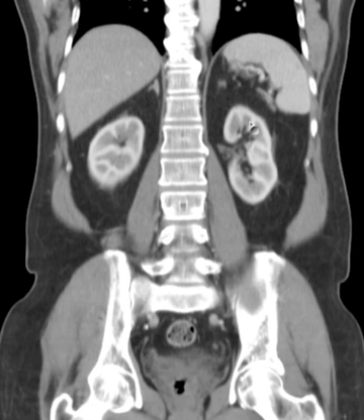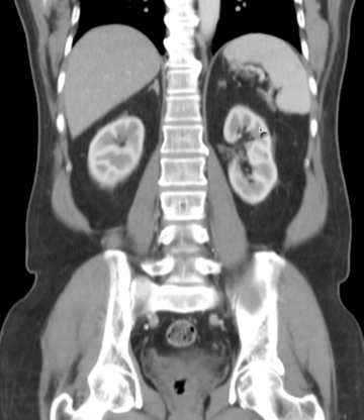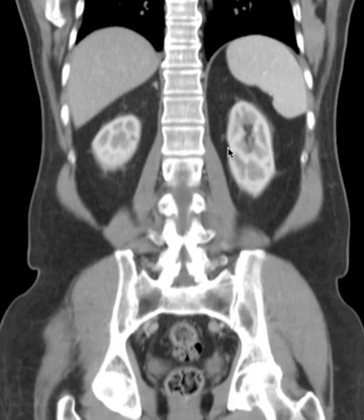Look at the nice corticomedullary differentiation. Look how the renal cortex is enhancing, but the renal medulla is not enhancing, or not much. And remember that's because what is in the renal cortex — the glomeruli — and the CT contrast we use is excreted by glomerular filtration. So initially, all of the contrast that comes to the kidney comes out through the glomeruli and therefore in the cortex. A nice depiction of that.